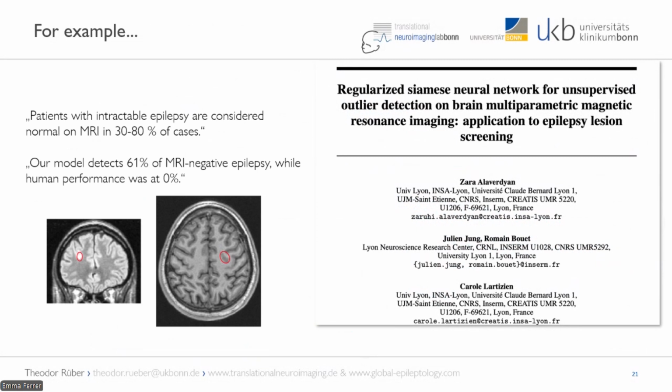But now if you look at some of the cases presented, you see that the lesions they describe can be seen really on a small thumbnail. So the reason the performance was 0 is probably that this was evaluated by the authors themselves, who were not radiologists.